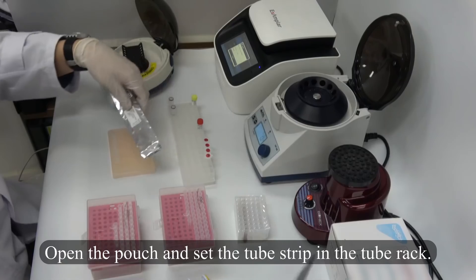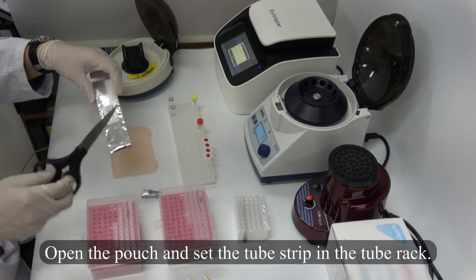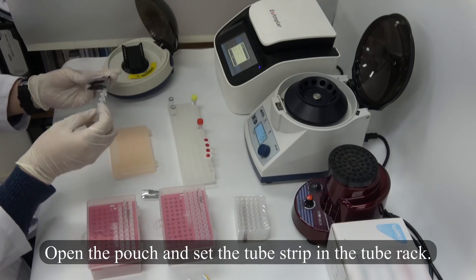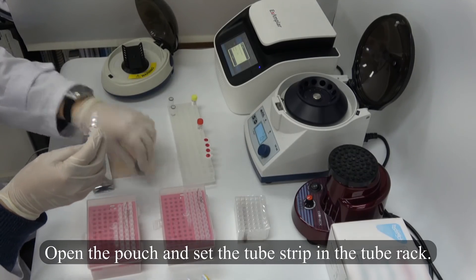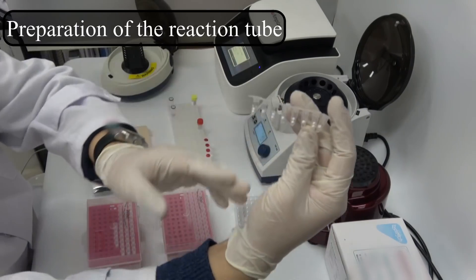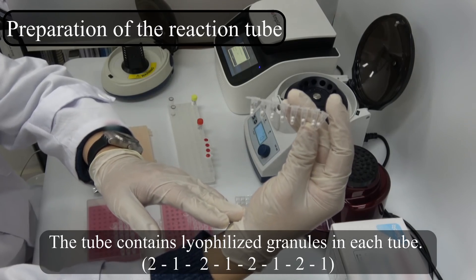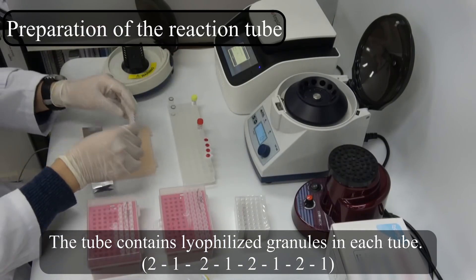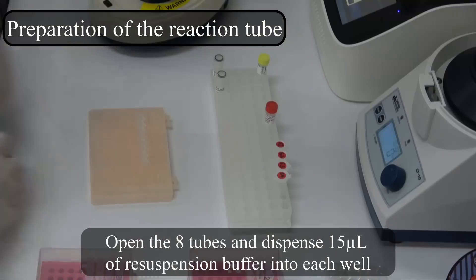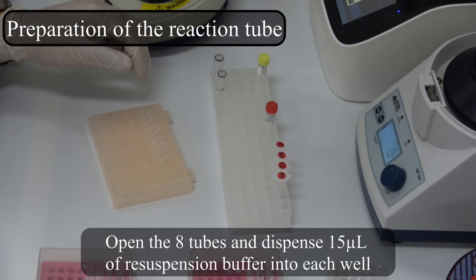Open the pouch and set the tube strip in the tube rack. Preparation of the reaction tube. The tube contains lyophilized granules in each tube. Open the 8 tubes and dispense 50 microliters of resuspension buffer to each well.